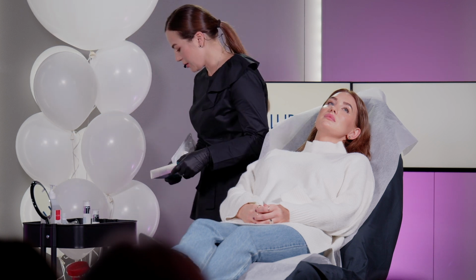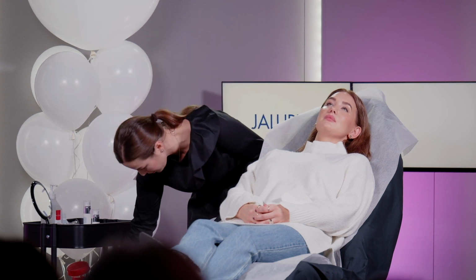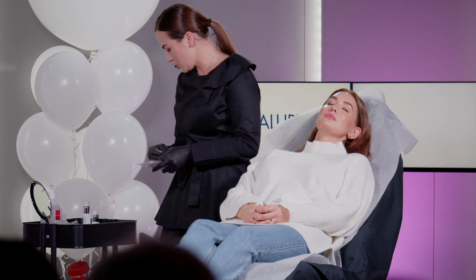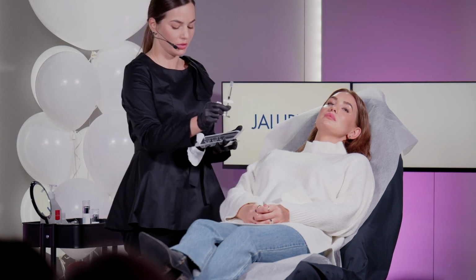For these injections, I usually take a 30 or 32 gauge needle. And if it's needed, I change on each side. If you feel it's not comfortable, better to change, to not make the patient suffer. So this is a ready product.